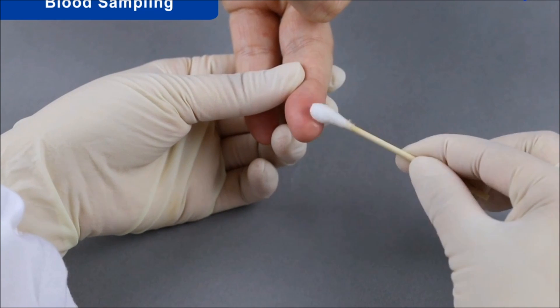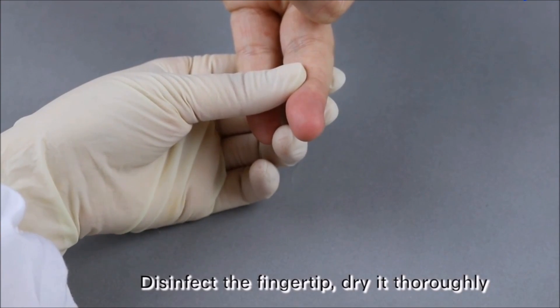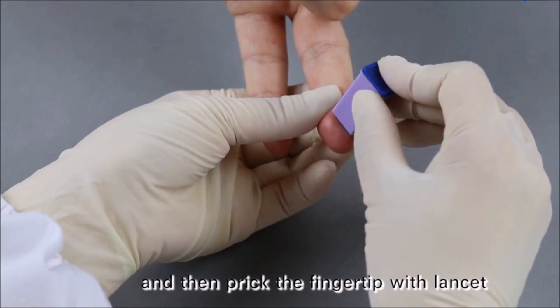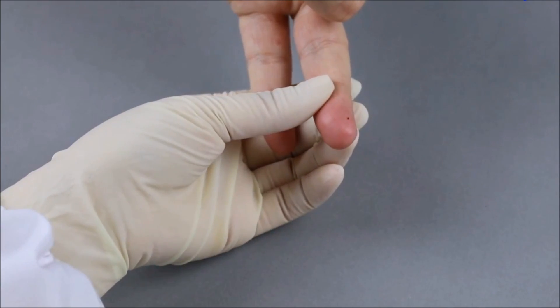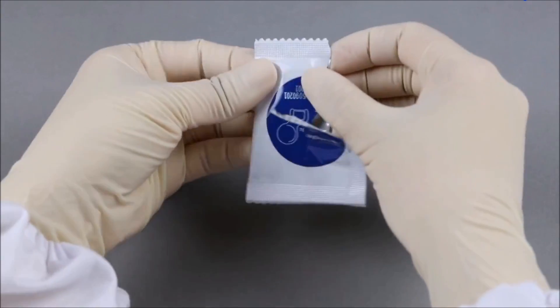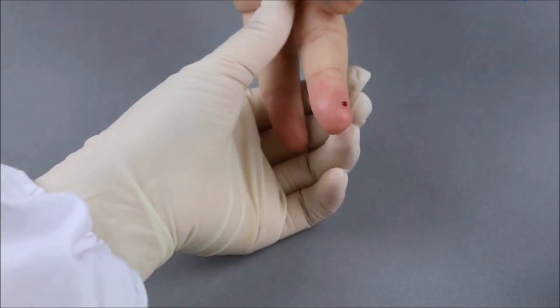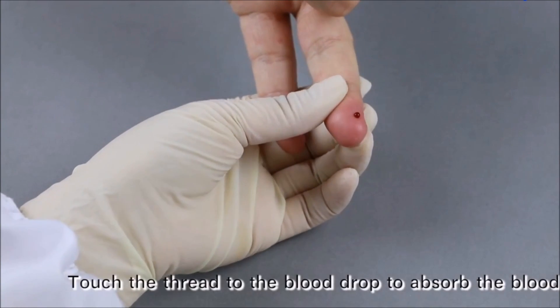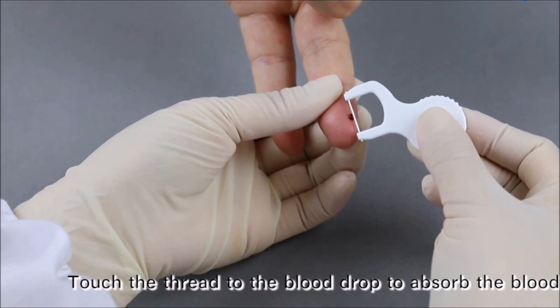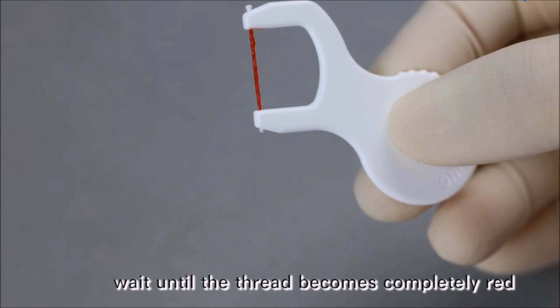Blood Sampling: Disinfect the fingertip, dry it thoroughly, and then prick the fingertip with a lancet. Take out a sampler. Touch the thread to the blood drop to absorb the blood. Wait until the thread becomes completely red.